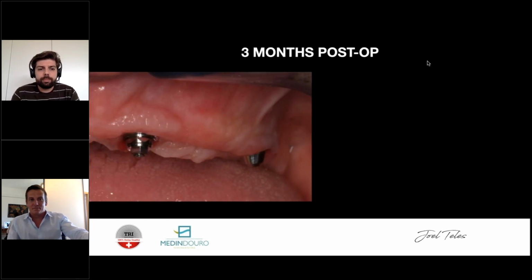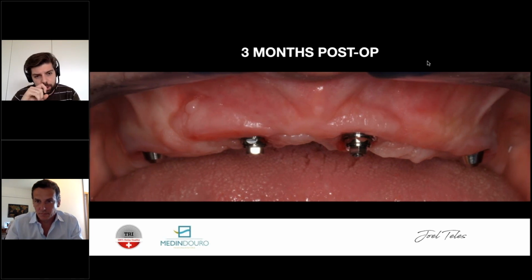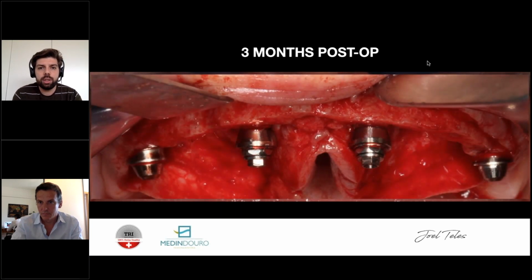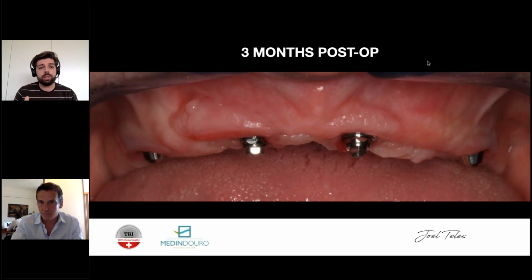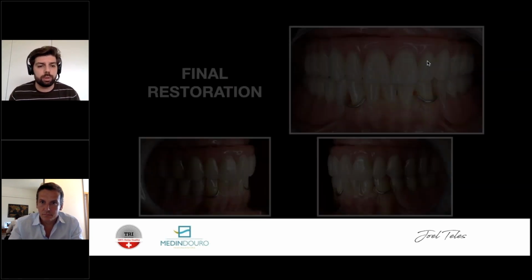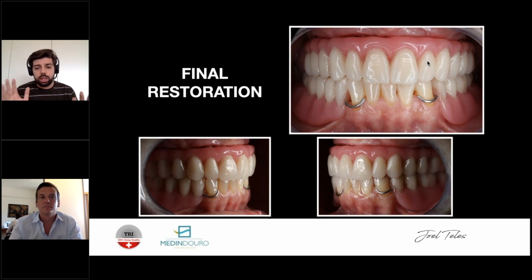After 3 months, this is what we get. Look at the tissue stability. This is always like this in a palatal approach. Tissues are always very thick around our multi-unit abutment. Remember, we came from this situation to that situation. And this is the common thing that will happen if you start doing these approaches more palatal than normal in these resorbed bridges. This is a perfect example for when you're starting to do the palatal approach, because it's very easy to do. Just think where you're going to place your implant. So okay, this is the final result.